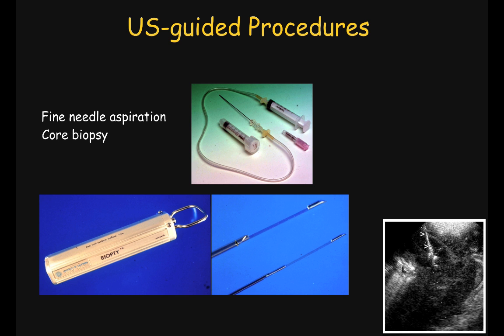The important safety measure to take is to visualize the lumen to make sure that the needle can be safely advanced and not penetrate the lumen, to avoid potential leakage within the abdomen.